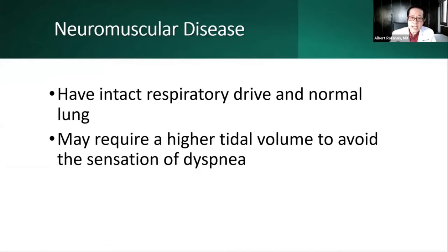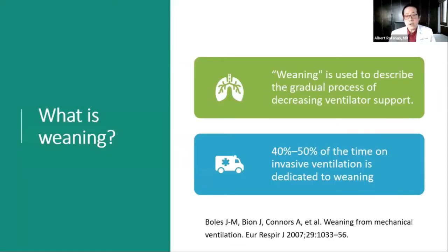Neuromuscular disease patients have intact respiratory drive and normal lungs and may require a higher tidal volume to avoid the sensation of dyspnea. So this is the last part, weaning. We'll just do this very quickly.